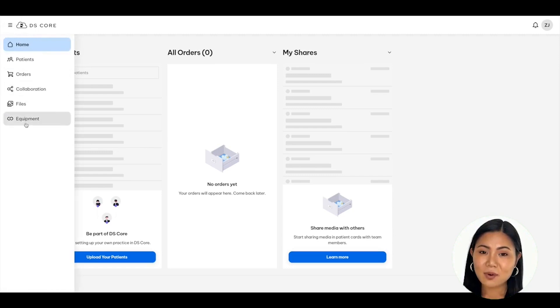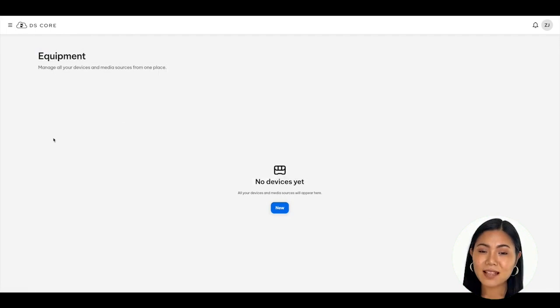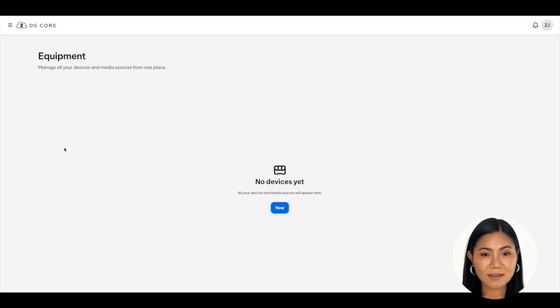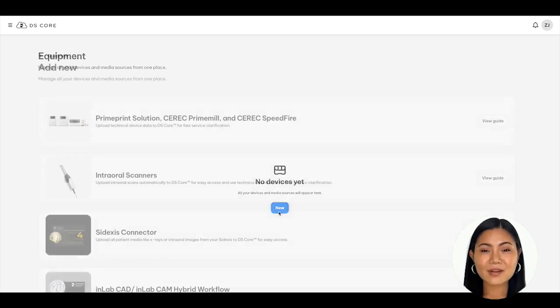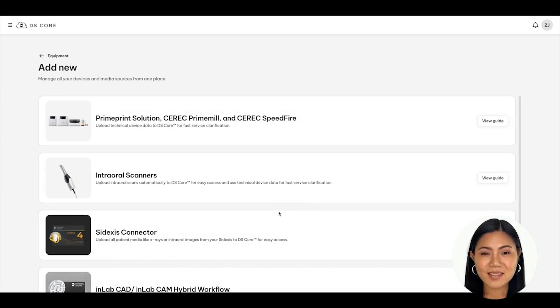Move your cursor to and click on Equipment. You will now see the equipment section where you can manage all your devices and media sources in one location. Since you are new to DSCore, this section should be blank and look like what's shown on the screen.